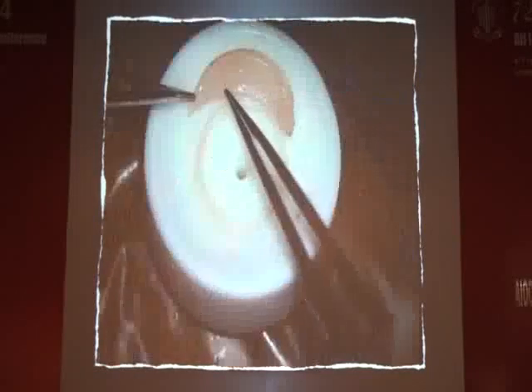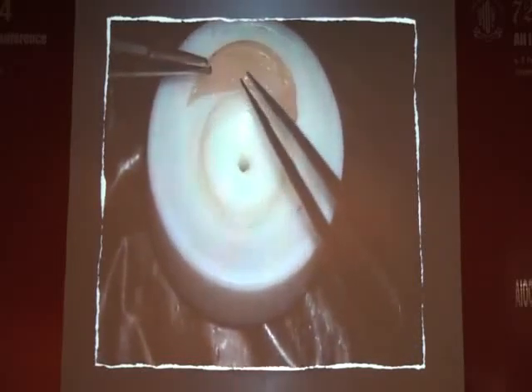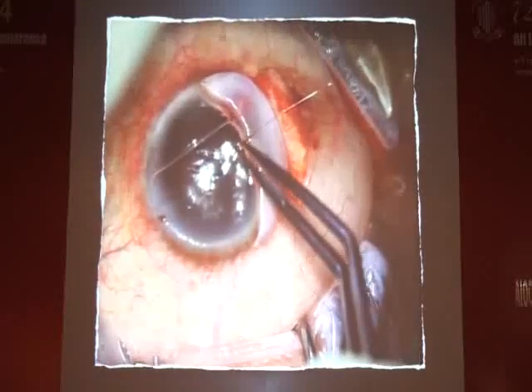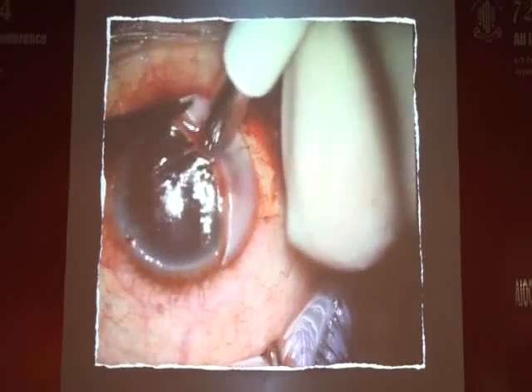You'll of course be fine-tuning it on the recipient eye. And here, because it's full thickness tissue, the DM can be peeled off. The patient has his own DM in the area of surgery. And the same process then ensues. You just use one of the matched margins to get your graft in.